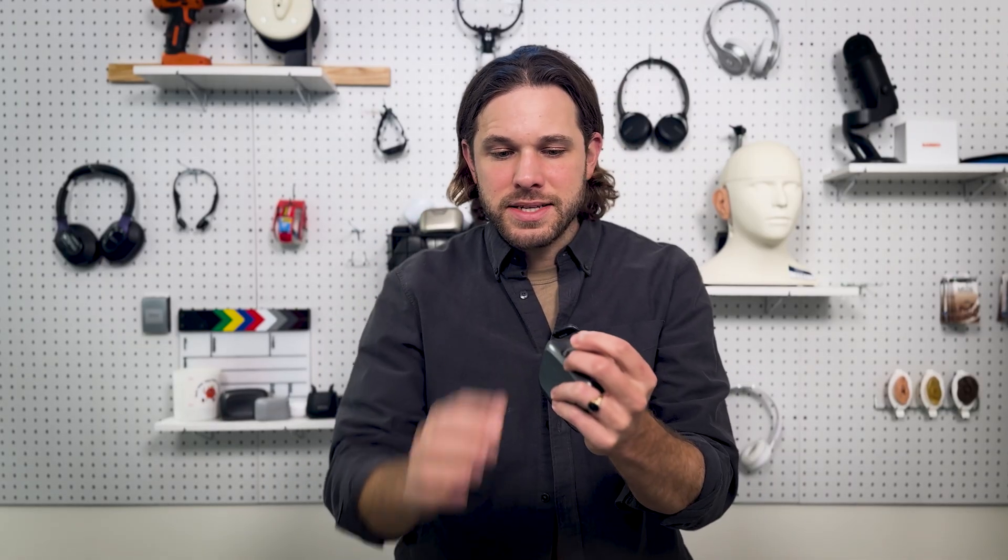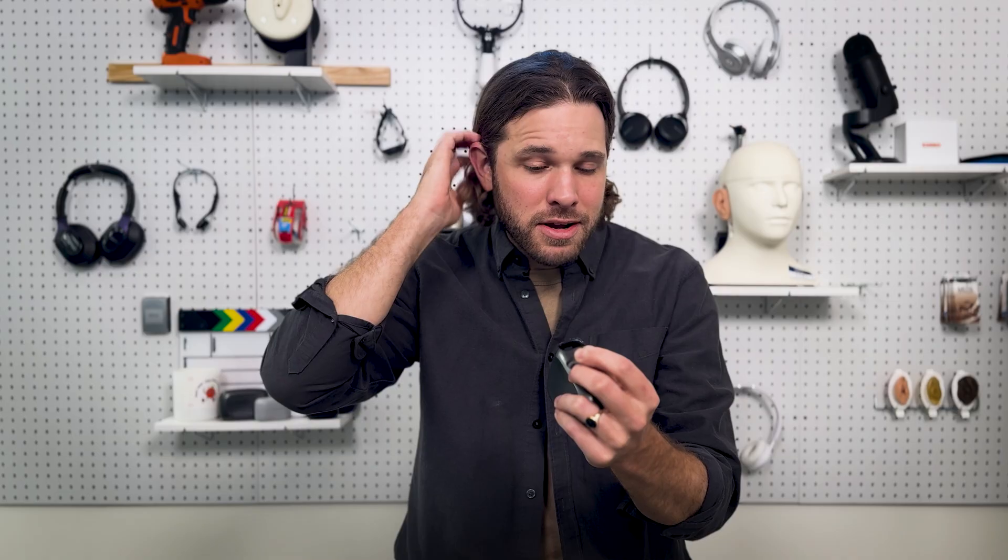We're talking about the ReSound Vivia hearing aid. This is a receiver-in-canal device — the body sits behind the ear, a wire goes up over the top of the ear, and there's a speaker that plays sound into the ear. ReSound hearing aids are prescription, meaning you'll find them at many local clinics. Unlike over-the-counter products, you won't program your ReSound hearing aids yourself — instead, a local professional will program the devices to match your individual hearing loss.